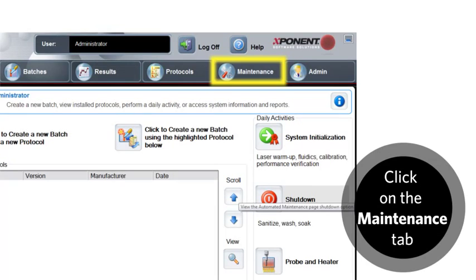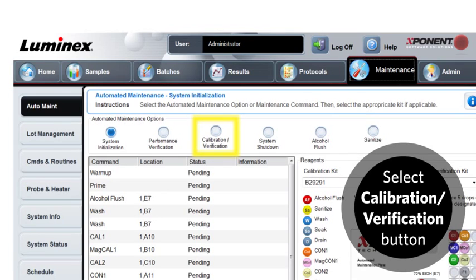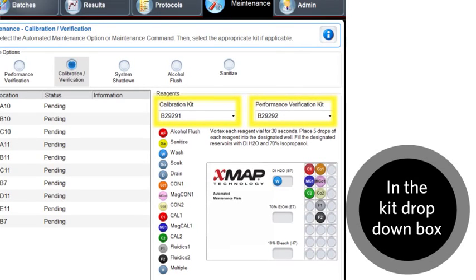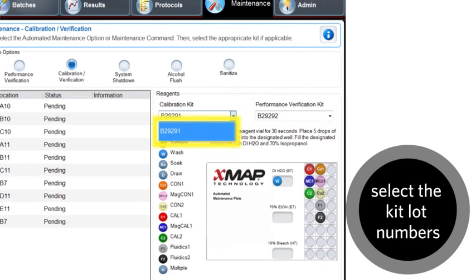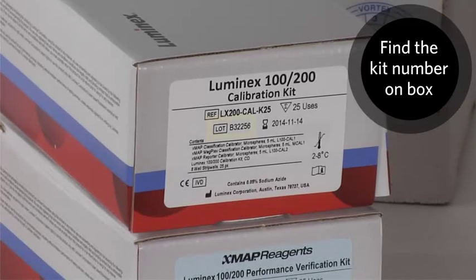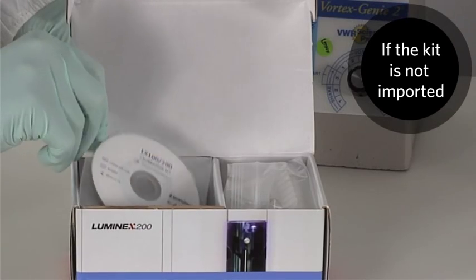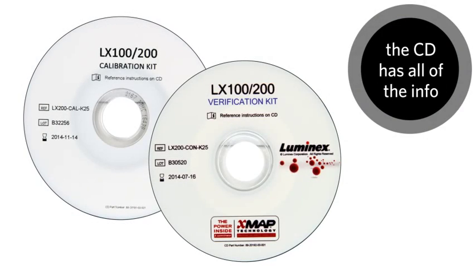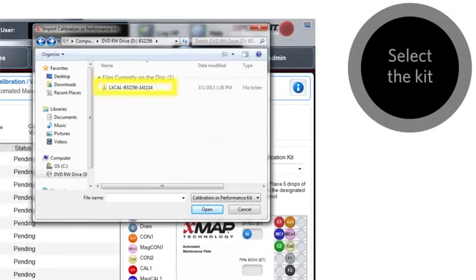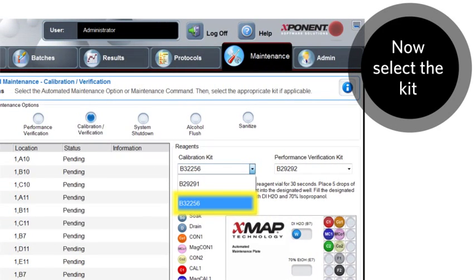Click on the Maintenance tab in the software, then click the Auto Maintenance tab. Select the Calibration Verification radio button. In the calibration kit and performance verification kit drop-down boxes, select the kit lot numbers being used. The kit lot numbers can be found on the kit boxes — make sure these numbers match or your calibration will be off. If the kit isn't already imported, there is a CD that comes inside the kit box with all of the information for your kit. Insert the CD and click the Import Kit button. Select the kit you want to import on the CD and click Open. After the kit is imported, select that kit from the appropriate drop-down box.